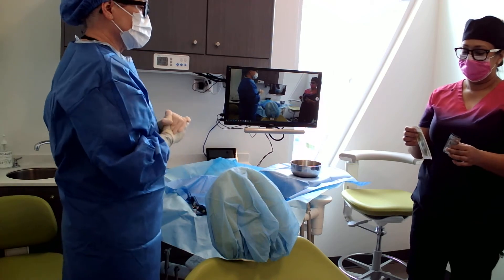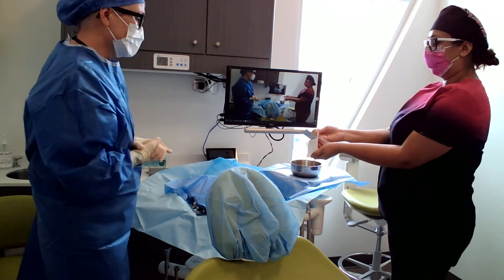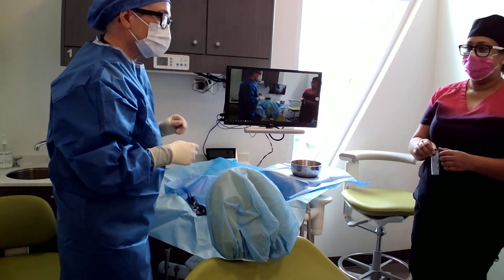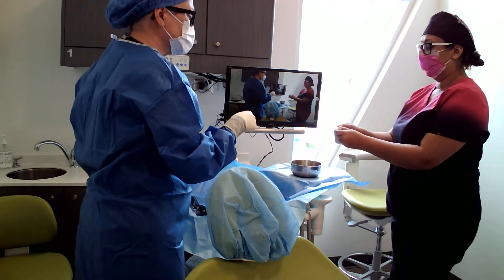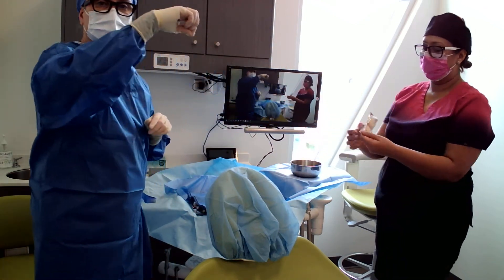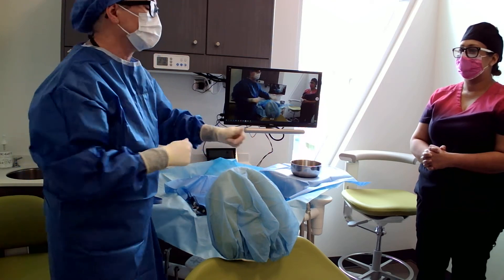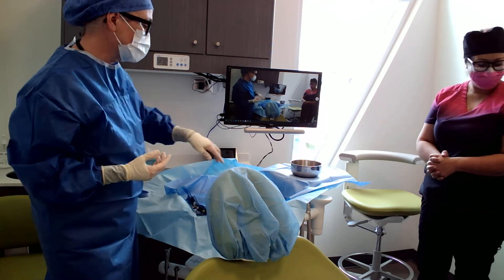I'll have those sutures, please. She can't just throw the whole thing down onto the sterile field — that would contaminate it. With the blade, you can actually safely grab it out of the package because the sharp end is always facing down. Now, whenever I open a blade, I'm really conscious of where I put it, because sometimes you just open mindlessly and then wonder where it went. Whenever there's a blade on your tray, always say 'blade up' — there's a blade there, so be careful.